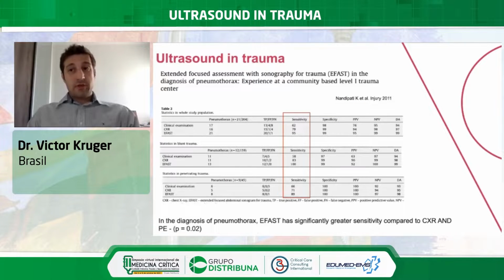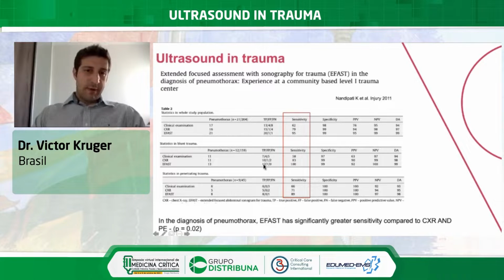When I talk about trauma patients in a trauma bay, in the head-to-head comparison of chest X-ray and EFAST, EFAST was superior. In this paper, you can see that for clinical examination, chest X-ray, and EFAST, in the whole population, the sensitivity of the EFAST is higher.